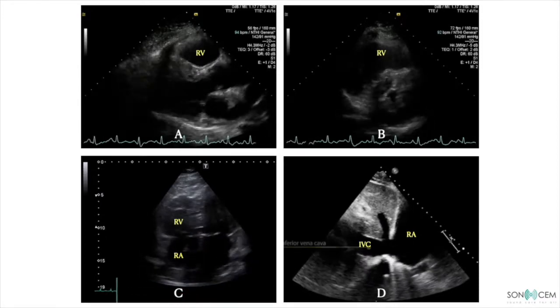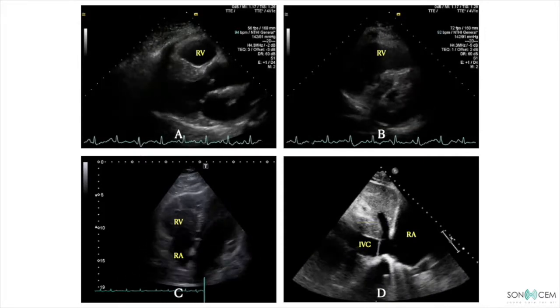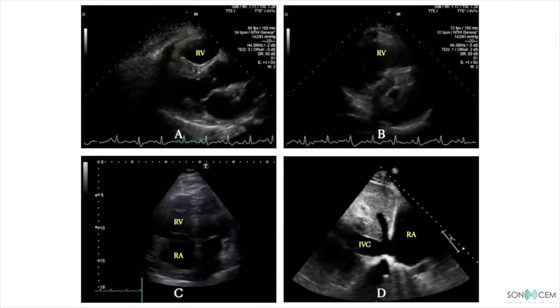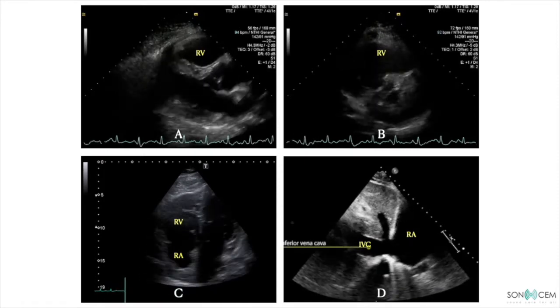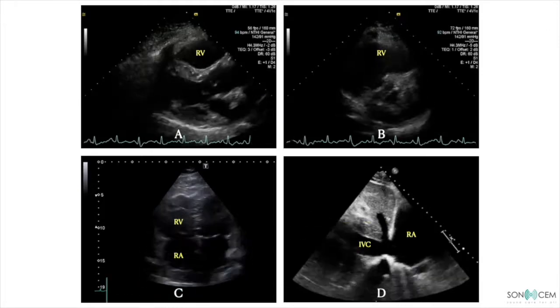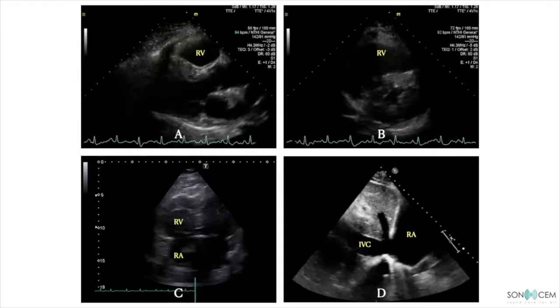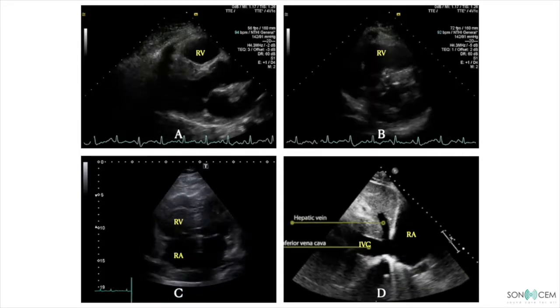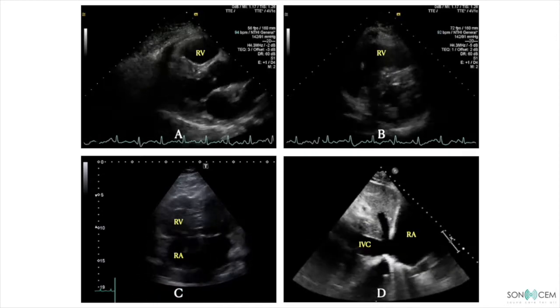In clip C, which is an apical 4-chamber view, the RV size is similar to the LV size. There may be evidence of chronicity as the RA appears a bit dilated. The IVC can facilitate the diagnosis of pulmonary embolism with its dilated size and lack of respiratory variations, denoting increased pressure in the right heart chamber, as you can see in clip D.